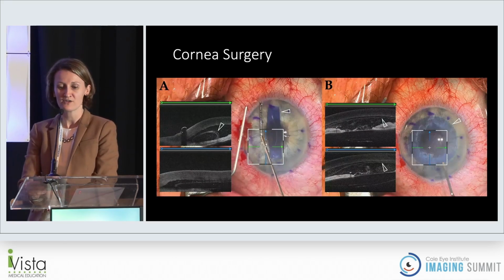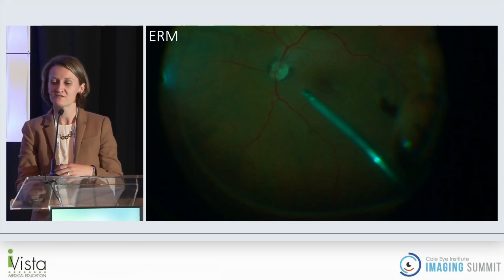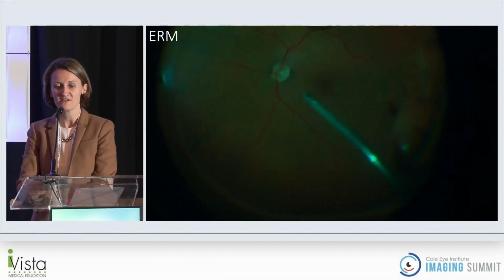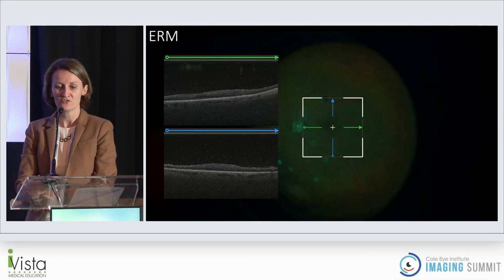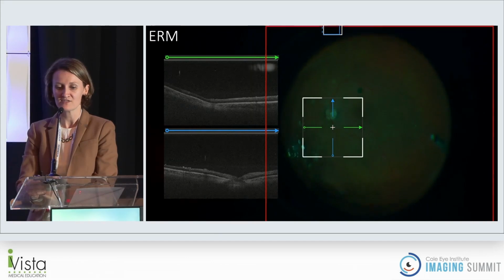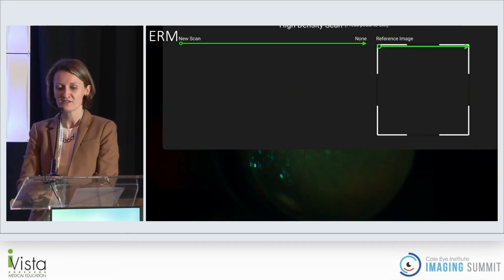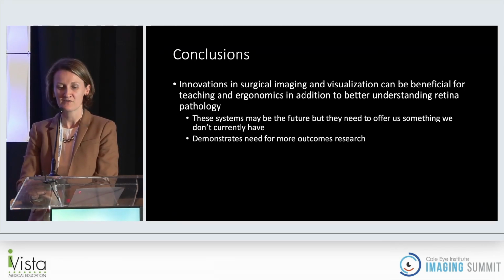It can be helpful for things like cornea surgery, seeing good anterior resolution, as well as 3D for retina surgery. The video's not loading here, but here it goes. You can get real-time intraoperative OCT to see if there are any defects, really scanning around to see potential planes. That would be helpful to start. This can be really helpful when you're operating with fellows, as well as to see where the retina is.